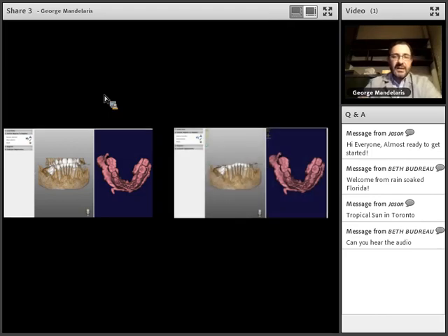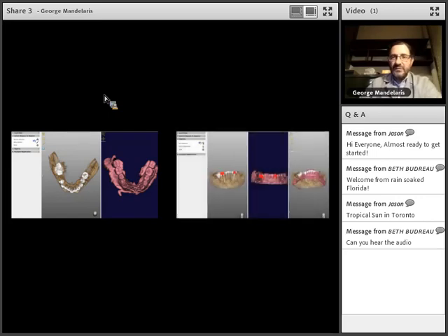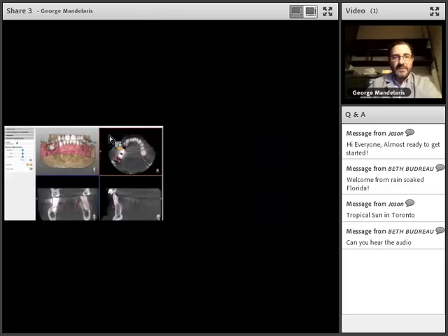So the first thing that we're going to do is remove a lot of the excess anatomy that we don't need to plan, which is going to be, as you see here, a number of the maxillary teeth. I'm then going to select several points, 3 in particular, to match the STL files, and then I'll select a few more to get that even more fine-tuned. So we add our landmarks in the CT scan, add our corresponding same landmark in the STL file, and then register the application.